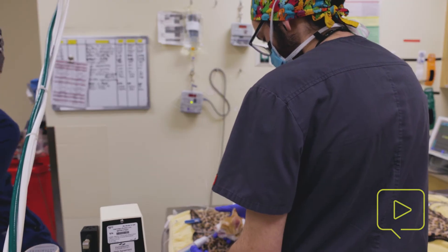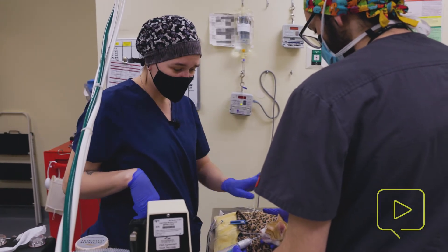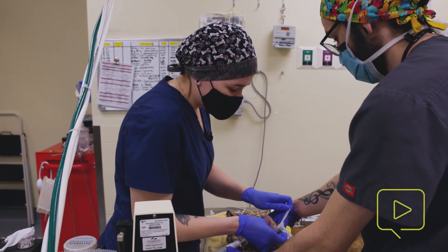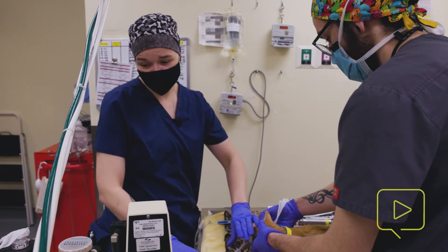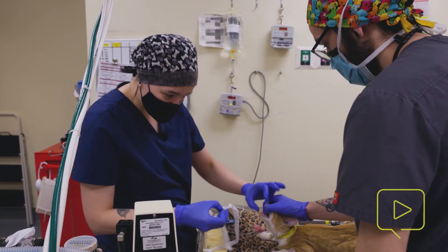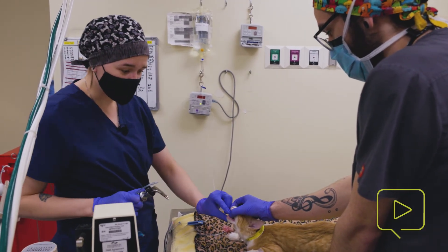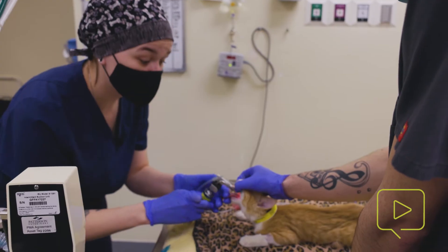Doing our leak check — trying to hold a breath for him — the pressure did not hold on my manometer, and you can actually audibly hear gas leaking around the ET tube. So we are going to try up a size on our ET tube. In kitties, every once in a while, because of the difficulty of placement, you might need to try once or twice to intubate them. But it is important to limit the number of times you are attempting to intubate. If you're not successful, don't be afraid to pass that off to another individual to try — especially in kitties, you increase the possibility of tracheal tear.